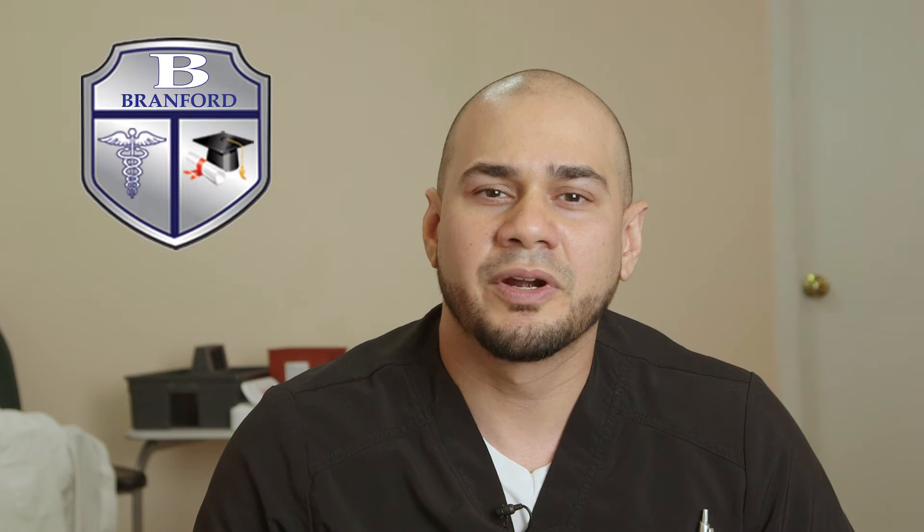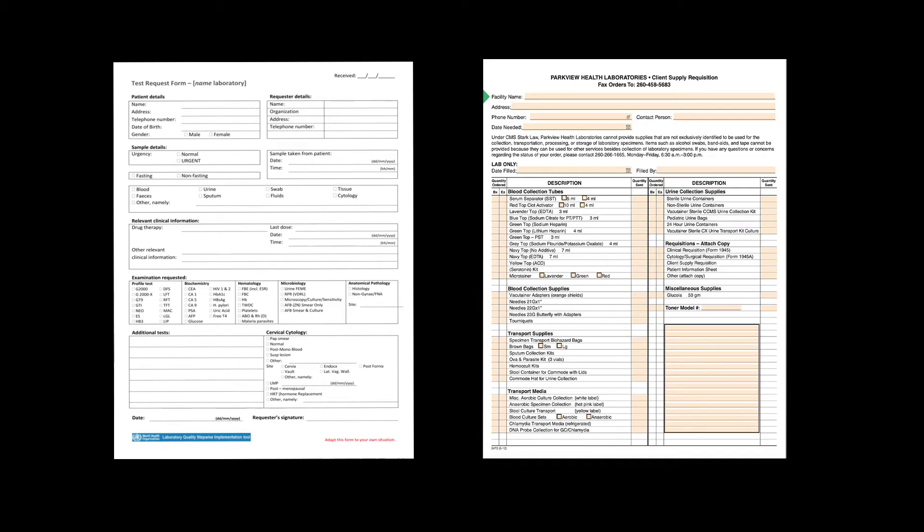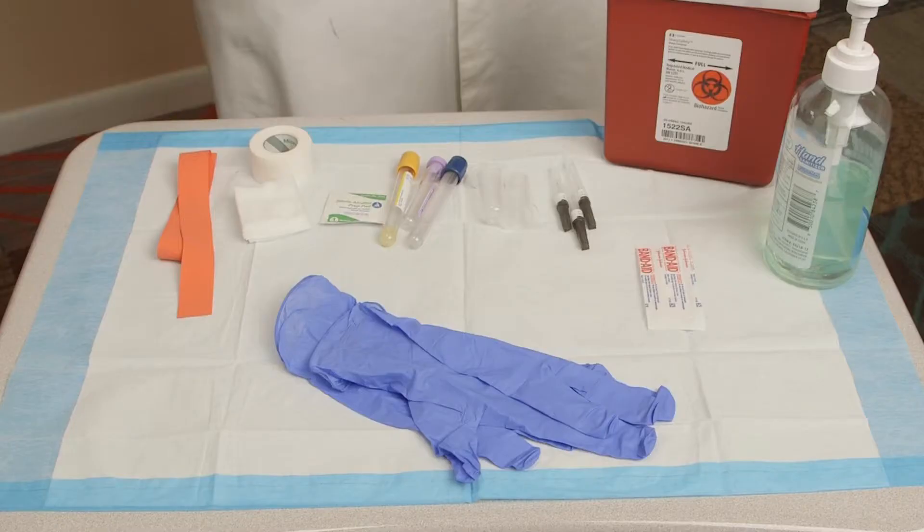Once you have the doctor's order for lab work, create a lab order. Look up the processing information in the lab test directory. Now gather the necessary supplies for the venipuncture procedure.